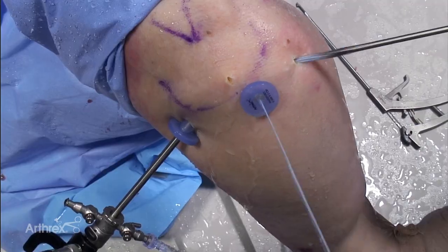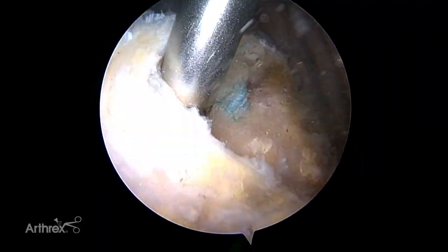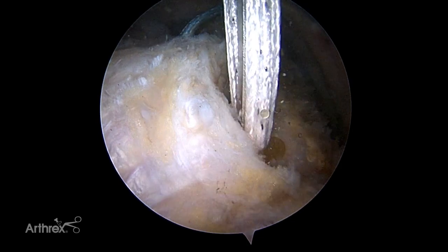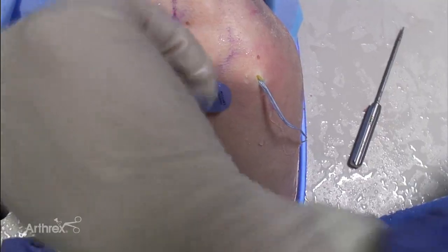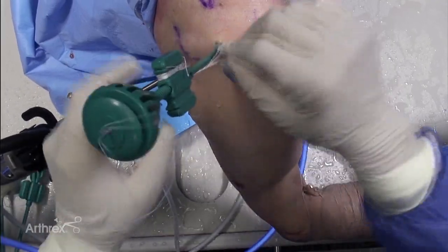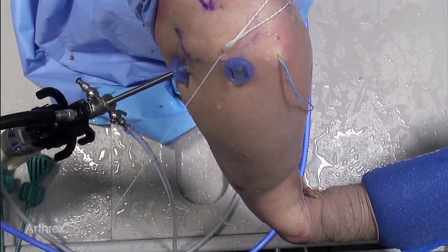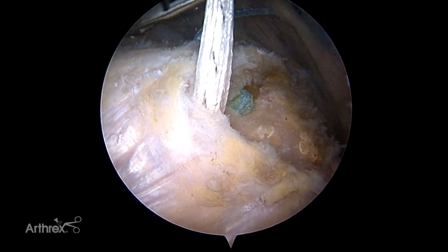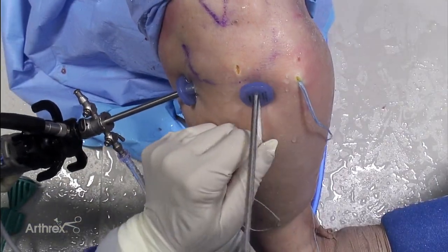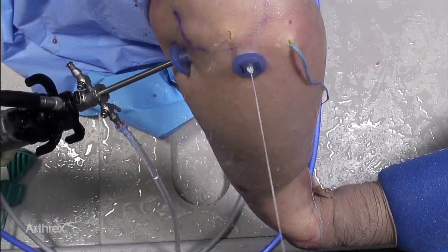The fiber tapes are moved to an accessory portal and the process is repeated for the posterior medial anchor. A vented swivel lock with a pre-loaded fiber tape loop is inserted into the socket. The pre-loaded fiber tape loop is released from the thumb pad and the number 2 fiber wire tip retention suture is discarded. The fiber tape is retrieved laterally. The fiber tape limbs are joined into a single tail to allow easy passage with a fast pass scorpion, which automatically retrieves the passed suture.